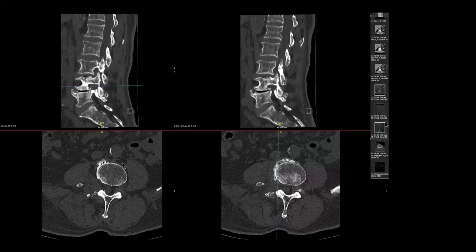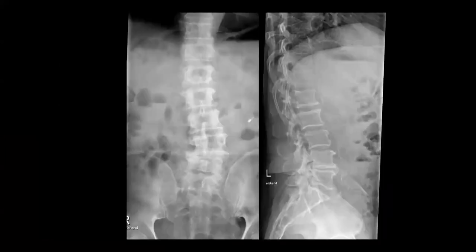This is the lateral view. And finally, the patient was treated endoscopically. You can see here the superior articular process of L5 is missing. This is only the bony resection. Of course, I'm resecting the capsular and the flaval ligament as well. And you can see on the axial view, there are some debris inside, next to the lamina. This is the rest of the osteophytes.